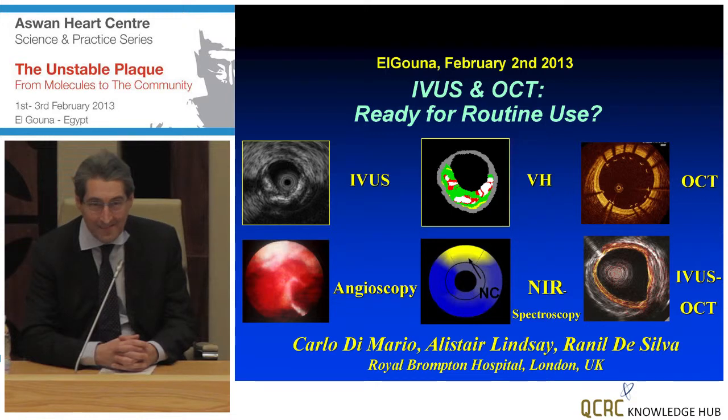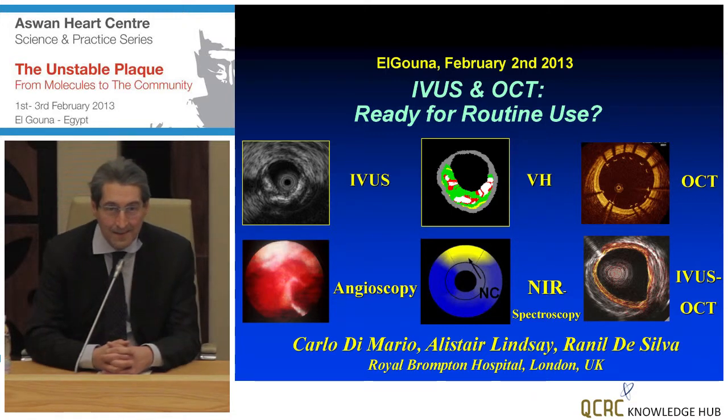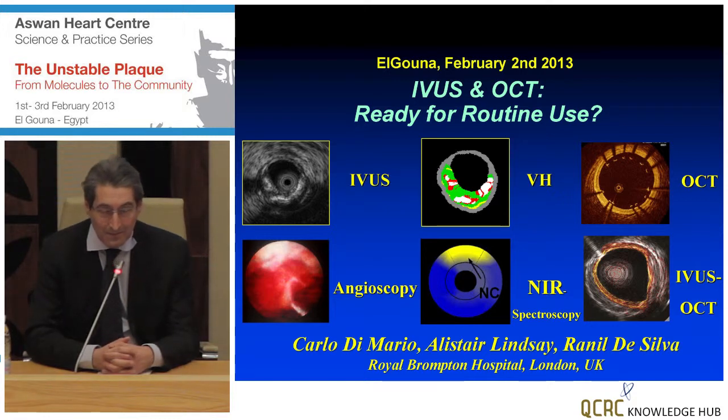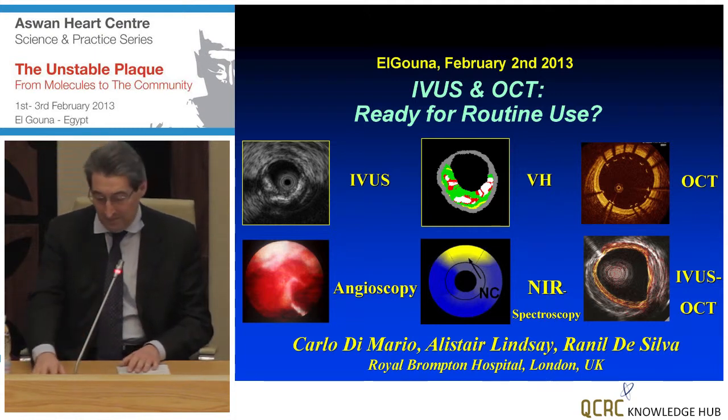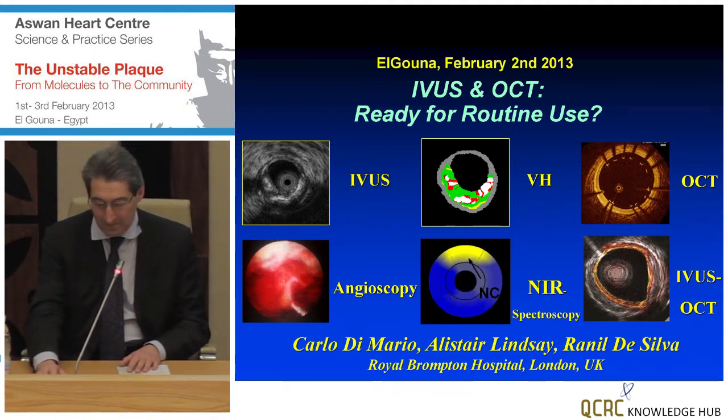Thank you for this lecture. Now we know the role of IVUS in guiding intervention by giving us data regarding the size of the artery. My question is regarding the accuracy of OCT to provide data regarding the size of the artery compared with IVUS. There is some data that it undersizes the dimensions.